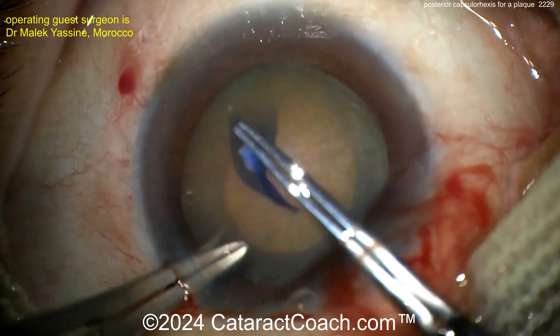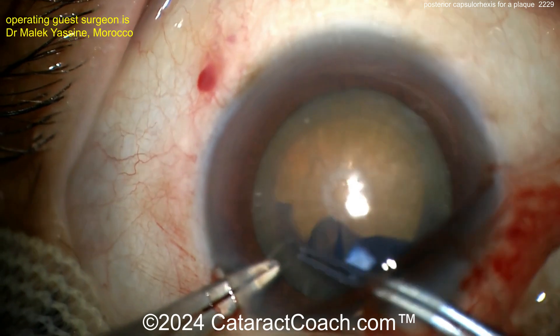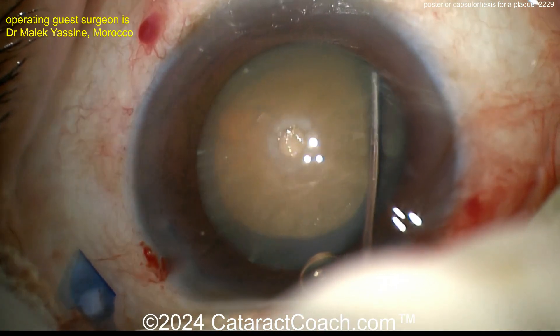Now you can see on the undersurface of the anterior capsule there's a big white fibrotic plaque. That's probably going to be indicative of what you're going to see on the posterior capsule.